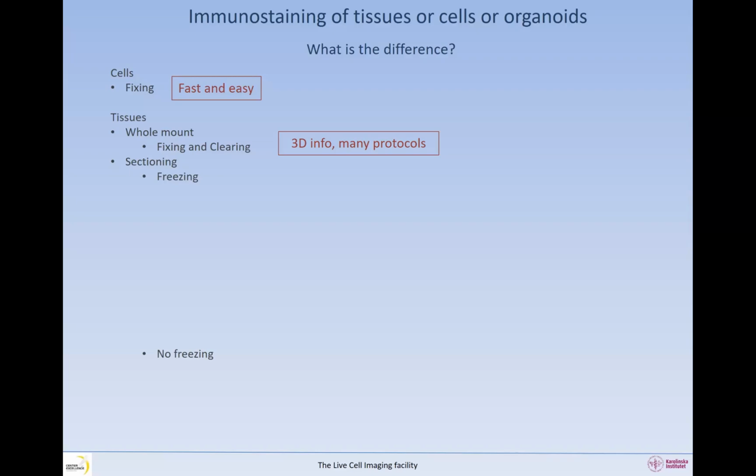Now, if you are freezing, you can take your tissue and freeze it at once, or you can first fix and then freeze.